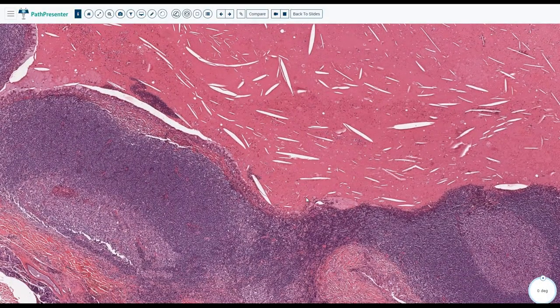Okay. All right. So I think this is overall what we get from a Warthin tumor. Again, we see oncocytic cells, papillary configuration, where there is cystic area and lymphoid aggregate, and it is related to smoking. It's the second most common salivary gland tumor after pleomorphic adenoma, and the most common bilateral benign salivary gland tumor, almost always exclusive to the parotid. I've never seen it outside the parotid gland, and simple surgical excision is enough for the case.